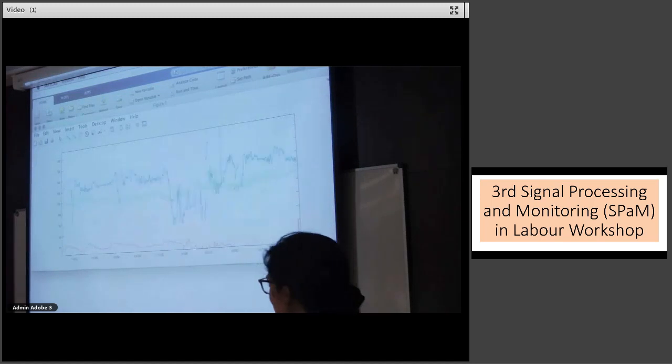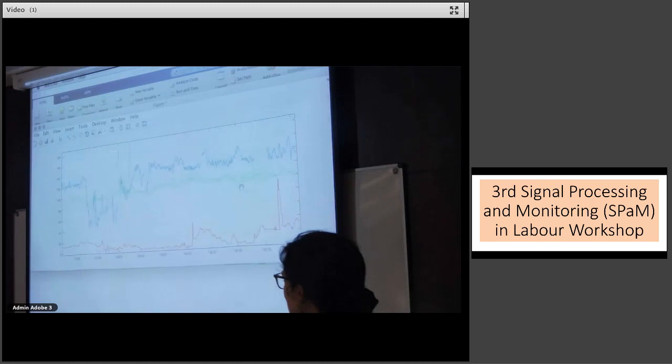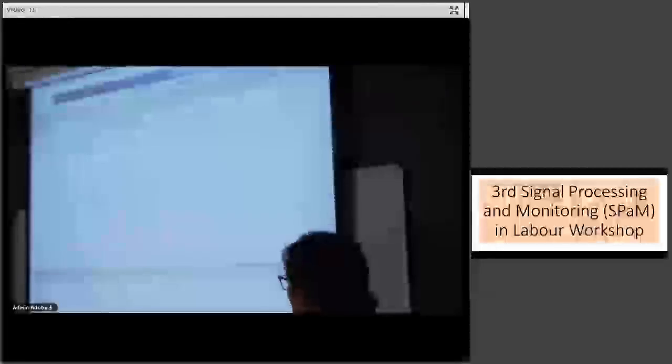Okay, let's move on. Thank you. So, yeah, continues. Prolapse. Somebody looking. Okay, let's move on, for the sake of time. Yeah, speak out. Yeah, please. Yeah, okay. So now I think the pattern, yes, please.